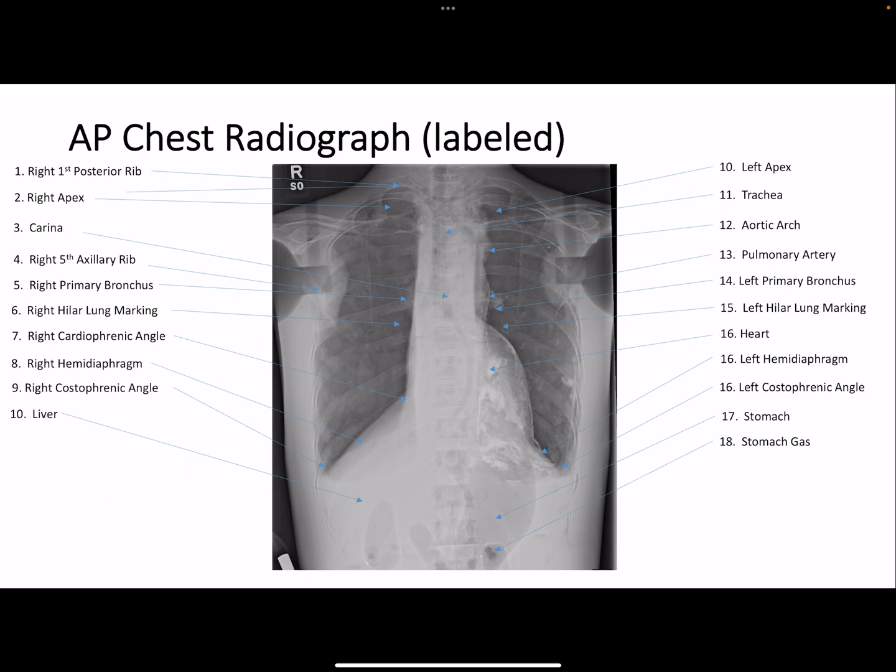Pathology best demonstrated. Clinical indications. Demonstrates pathology involved the lungs, diaphragm, and mediastinum.